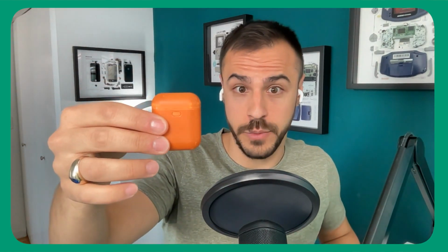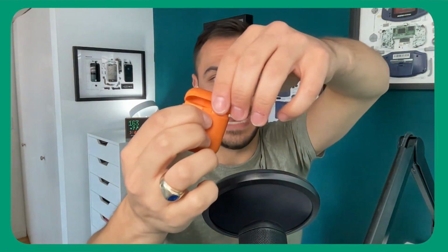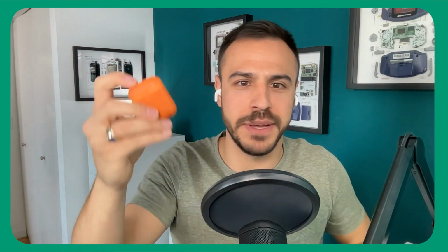We're going to get into Nate Ratcliffe in just a second. Before we do, I just want to show everyone who's watching on YouTube, I'm holding an orange link. An orange link wouldn't exist if there wasn't a RileyLink. I came into the game a little late. I was just diagnosed two years ago. But I'm on Loop, and I was using for a while this orange link, which looks like an AirPods Pro case. It's orange, and it holds two AAA batteries. But all of my friends would be like, oh, your AirPods are orange? I'm like, nope, this is not that. Please don't open it.